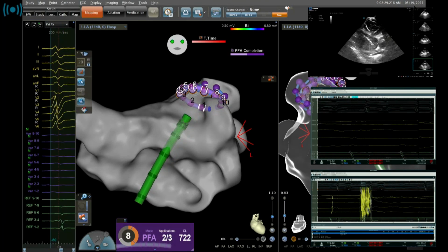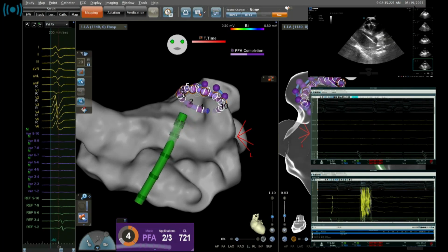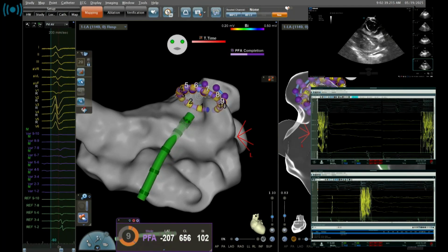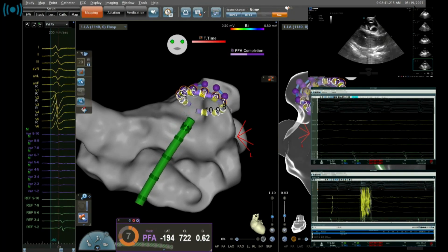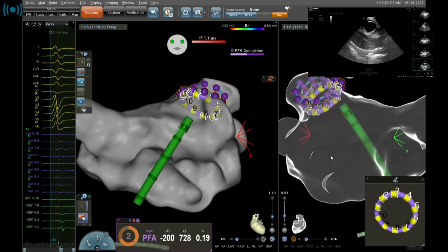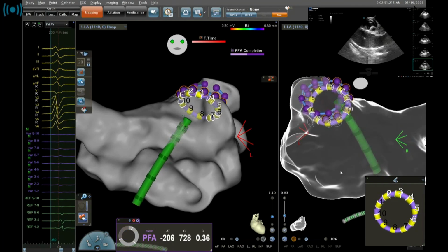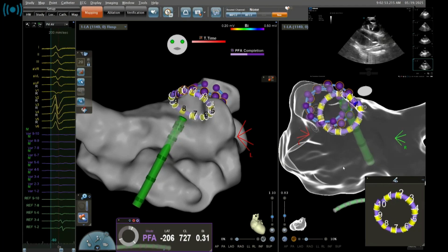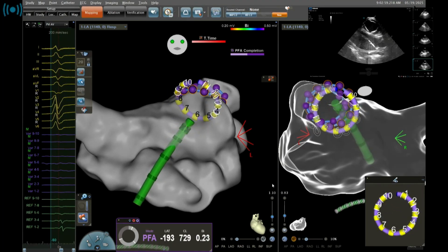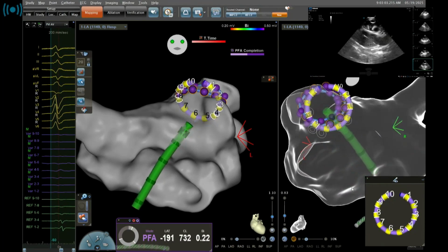Okay, so this is the last one now. The last? Okay, perfect. The last one. Now I rotate again 45 degrees, a little bit more. You see, now the gap is posterior superior, but with the larger sides of the catheter. I'm creating a big catheter shape just to cover the antrum of the vein. And we partially covered the left inferior vein too on the echo.